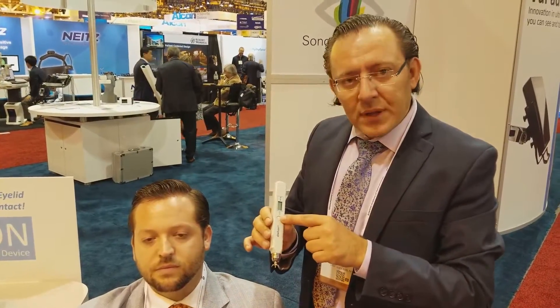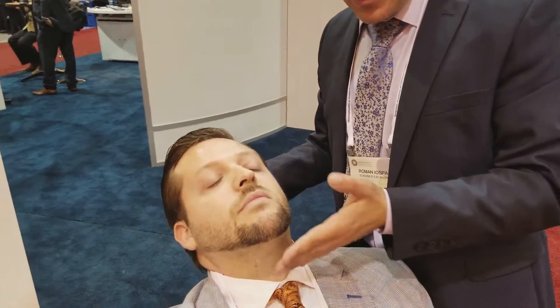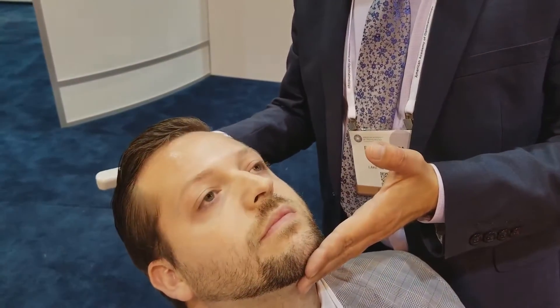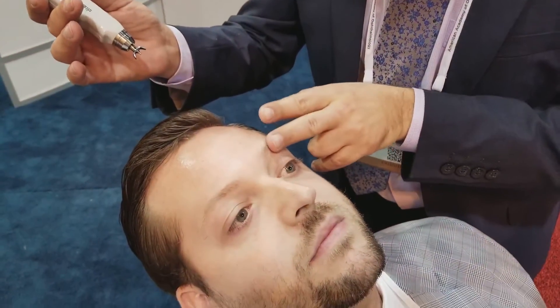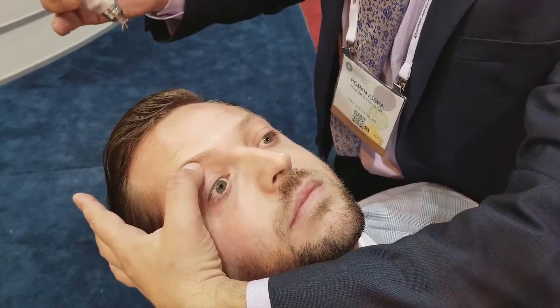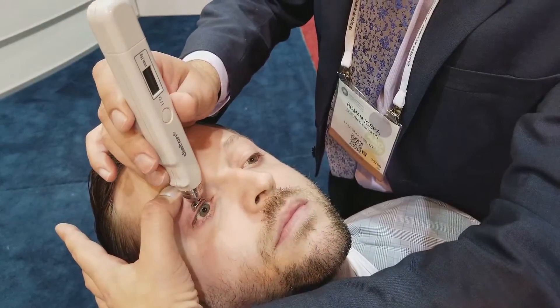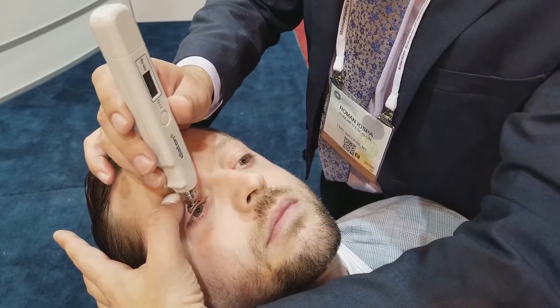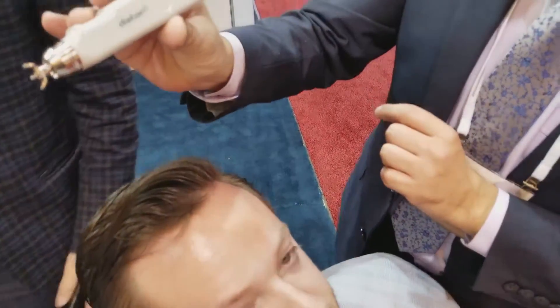For the other eye, stay on the same side of the patient. If you're right-handed, be on the left-hand side so you can rest the edge of your palm on the patient's forehead. Clear off the device, turn it back on — you're always starting with four zeros. Use your hand to push the chin up and support the patient's head. Use your index or middle finger to get the eyelid upward as the eye naturally opens, not to the side. On this side, use the thumb similarly. One important thing to avoid: don't let the lid slide onto the cornea — that's the biggest error. You'll get lower results because the device is calibrated for the lid and sclera. Take three readings, then press the button for the average.